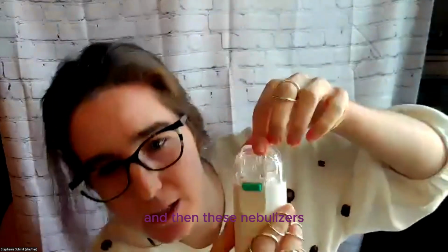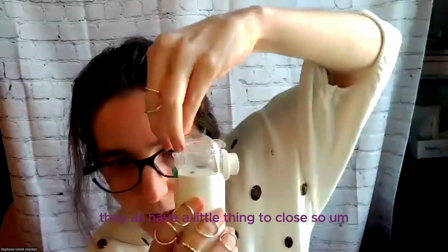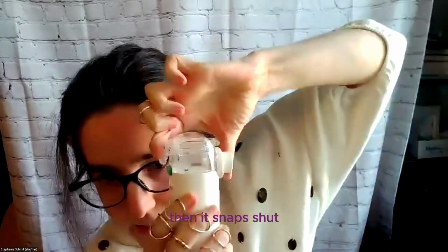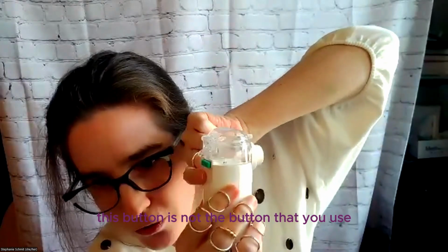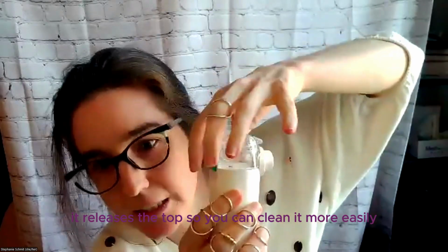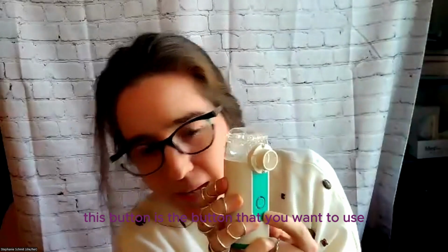And then these nebulizers, they all have a little thing to close. So you pour it in, you close the lid, then it snaps shut. This button is not the button that you use to turn it on. This button releases the top so you can clean it more easily.